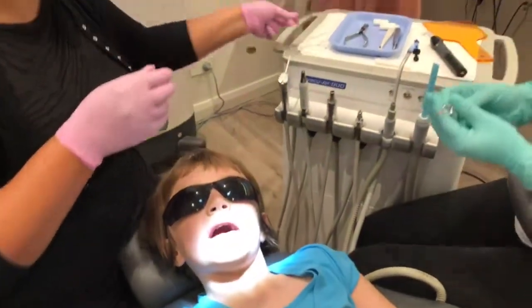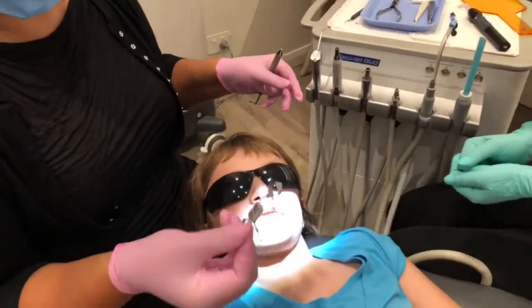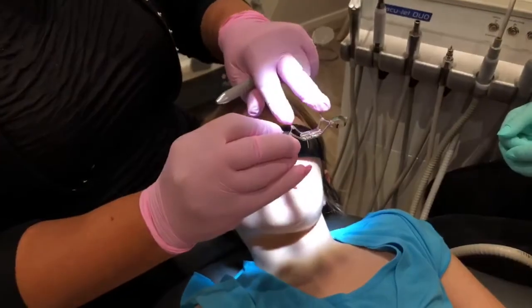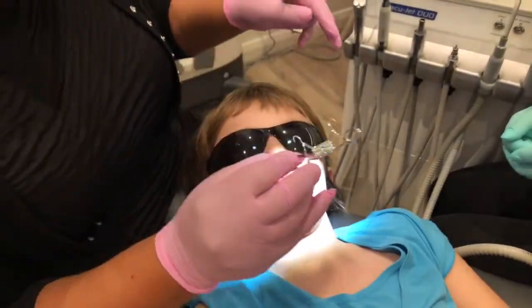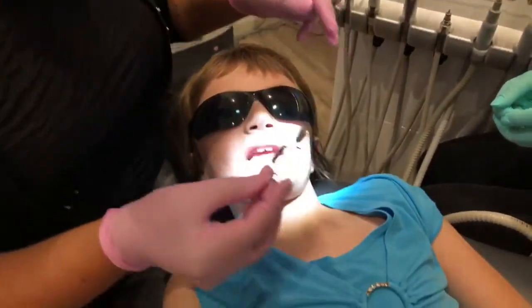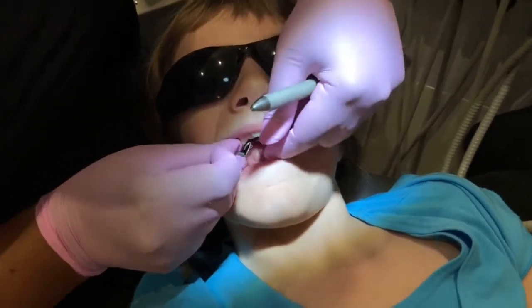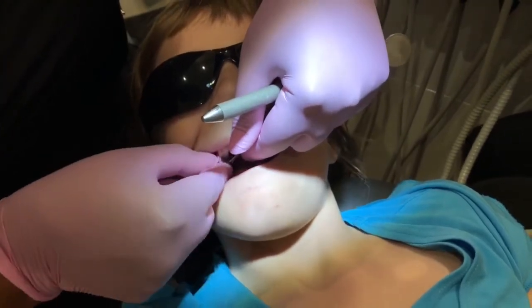The next step before you cement is always to try it on. So we've got a two-banded RME with rests on the D's. It's a mixed dentition Hyrax RME. So it's like trying a shoe on and we're going to get a little help here.